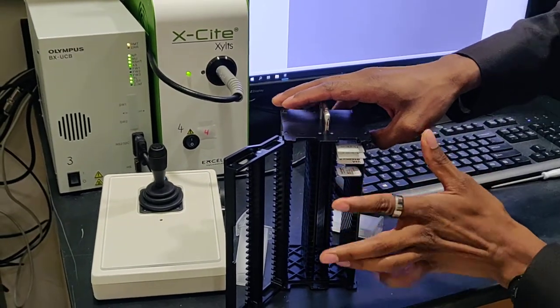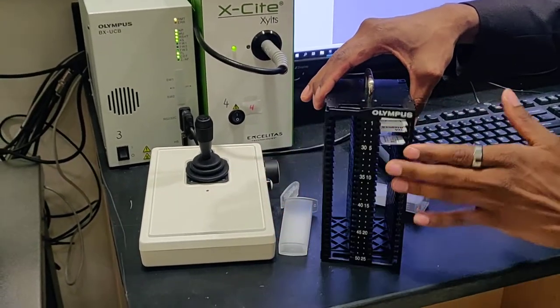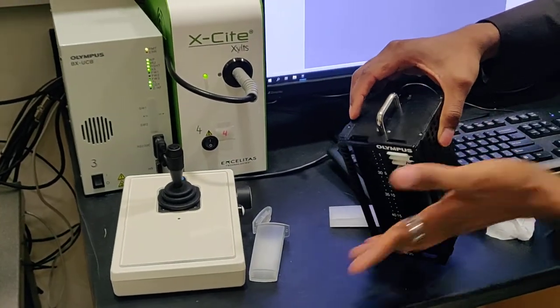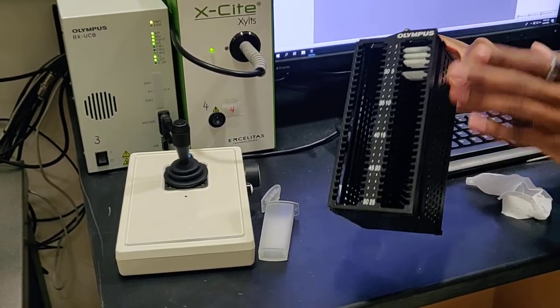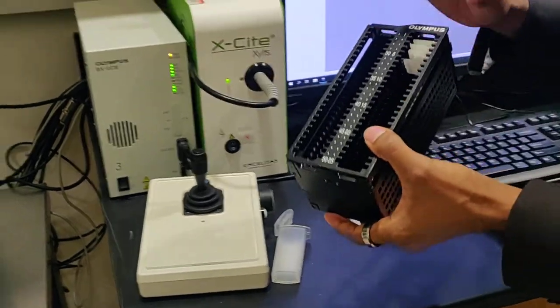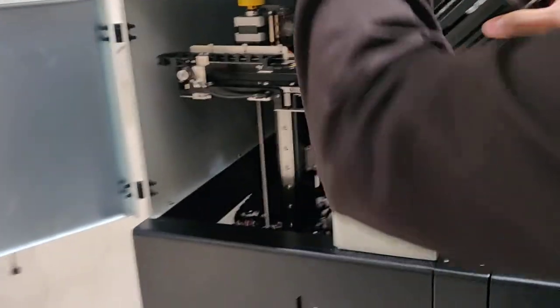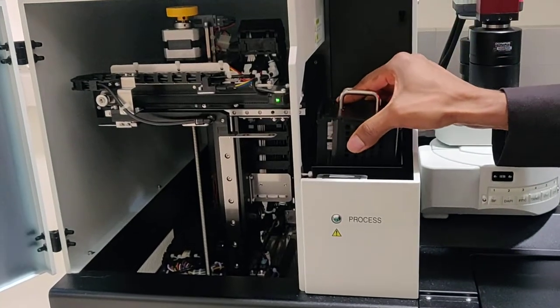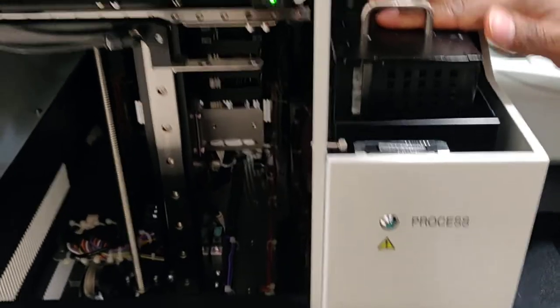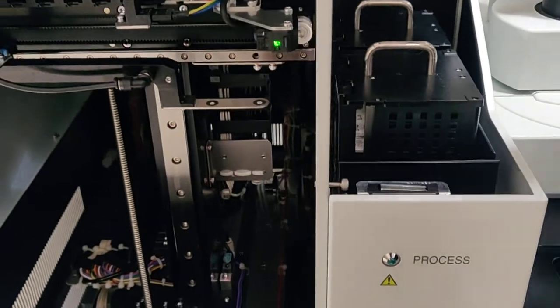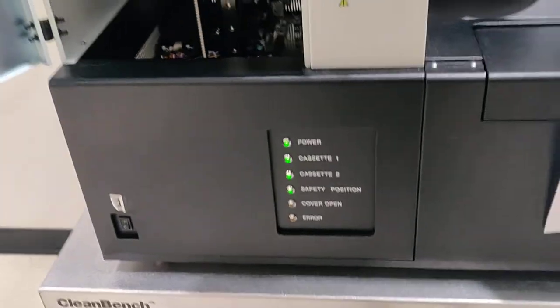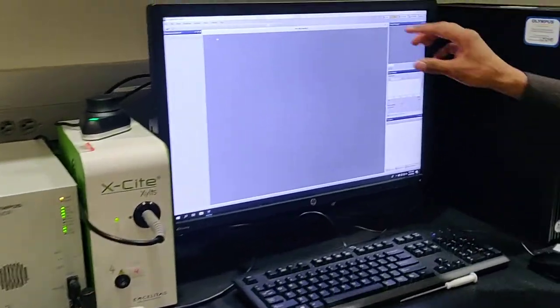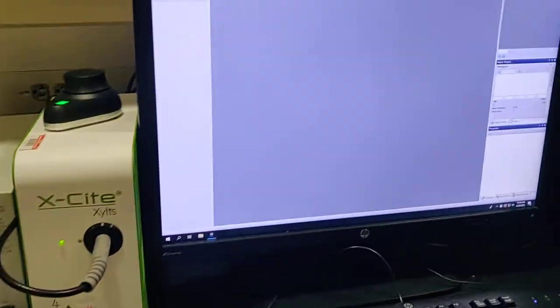I will place it in here. I kept a gap so I can identify where it is. And while loading, sometimes people push it like this and the slide pops out. Make sure it is not doing that. Lock it up a few times here like this. Everything is all set. All of them are green. I close the cover. Everything is fine.